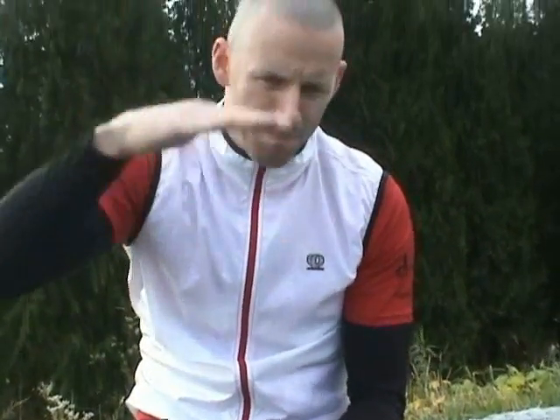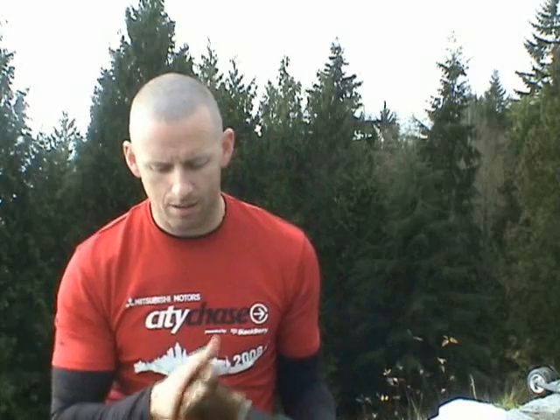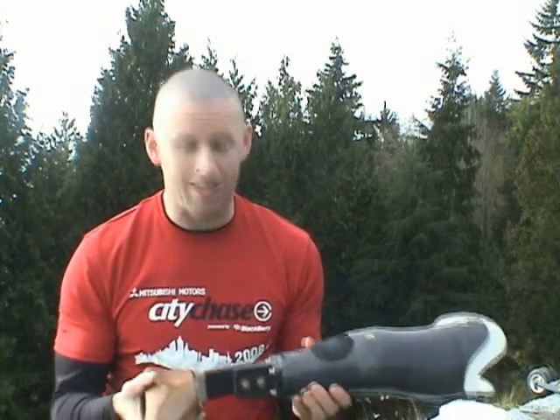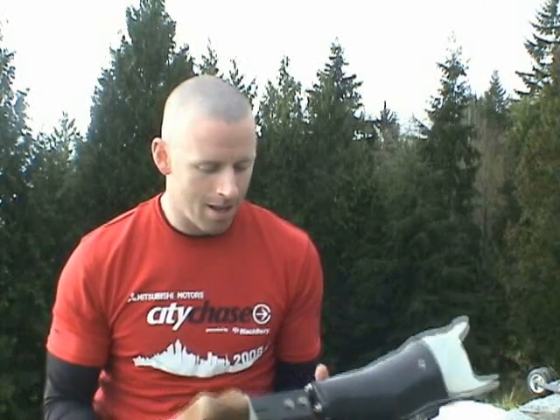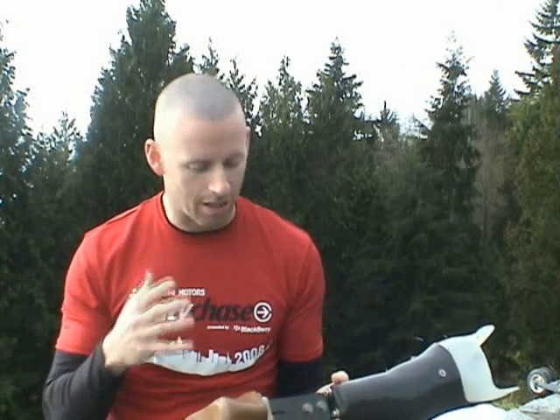Otherwise, you'll be bouncing along, going too high on one side or too low, and feel like you're jumping out of a hole every time you try to stride. If it's set properly, you should be able to run along smoothly. Before I got my running leg, I would run on my regular everyday leg, which is a Modular 3 Flex-Foot, which is actually thought to be a half decent active leg, even for running. When I didn't know any different, I thought it was okay.